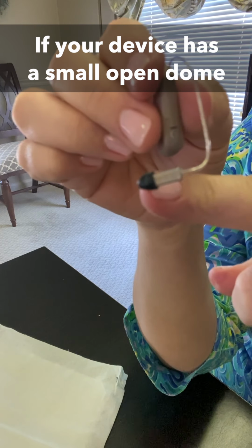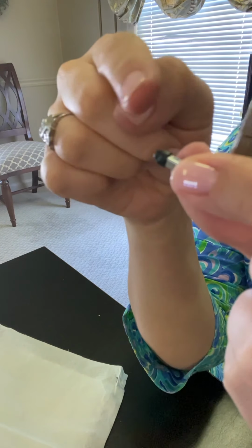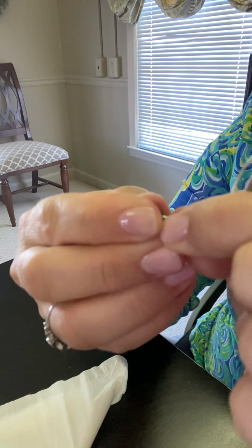Some people have these very small open domes on their devices, like on these Resound devices. It can be tricky to get these domes off. I prefer to use a tissue, and you just grab the dome through the tissue and pull it off. It can be helpful to rock it back and forth slightly to work it down a little bit. Then you pull it off. Very simple. To put it on, you find that little hole there in the middle. You line it up just right and slide the speaker into the middle of the dome. I like to push it on all the way, give it a tug, make sure it's on, and then push it down again.